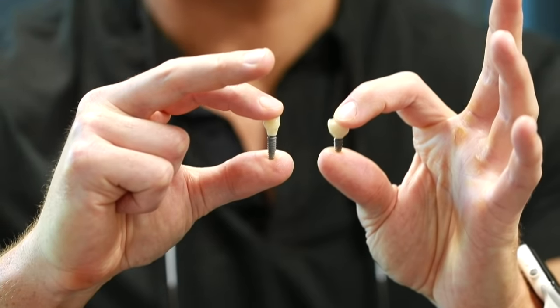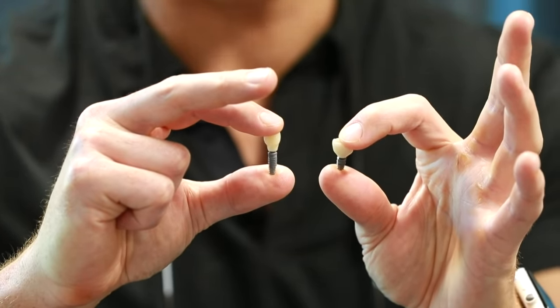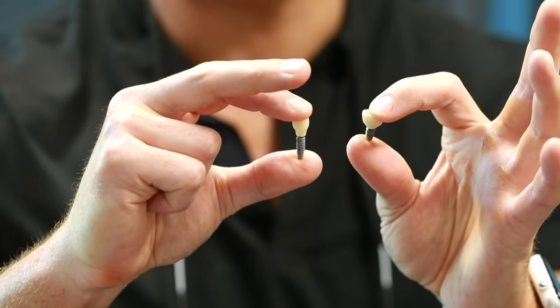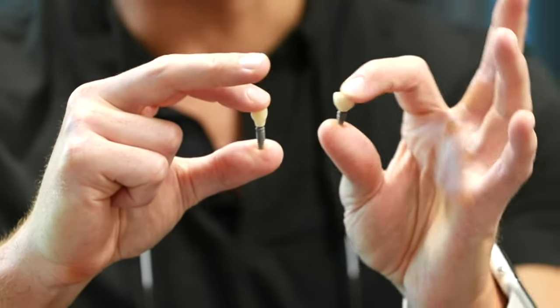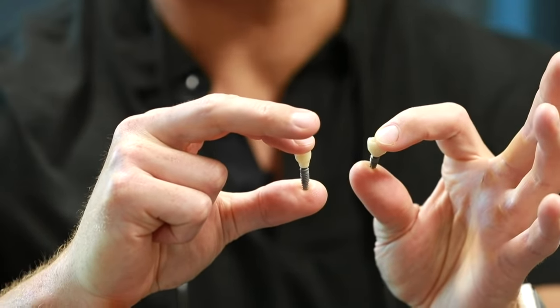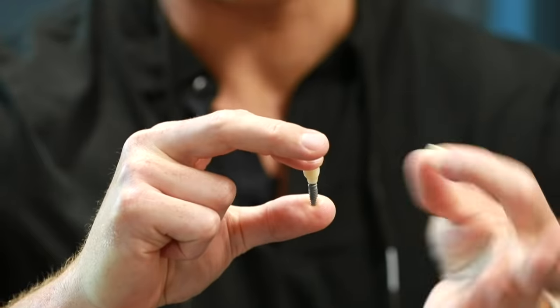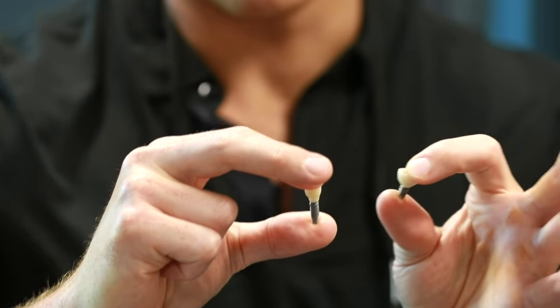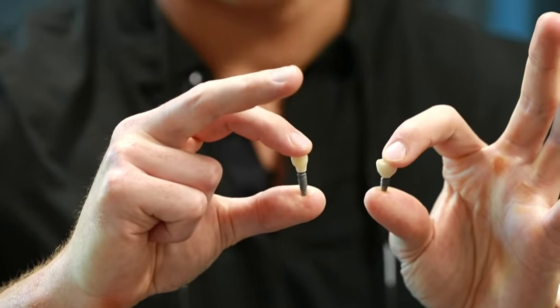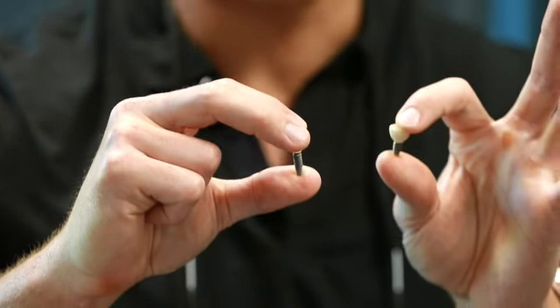Then there's an abutment that's screwed into that, or an attachment is the word I like to use, but we dentists like to use fancy words, so it makes us sound smart, I guess. The abutment is what we screw into the implant. And then on top of that, a crown is cemented or bonded. We use all porcelain, but there are a bunch of different options for that. You can see those put together. So those three components make up every implant.